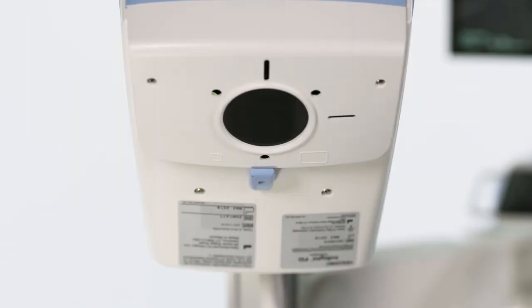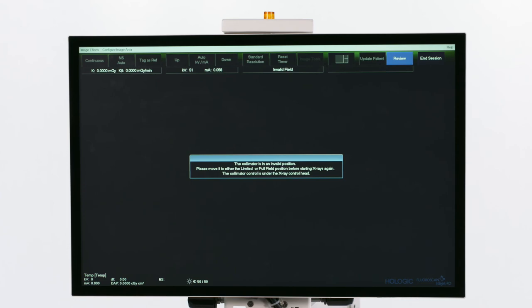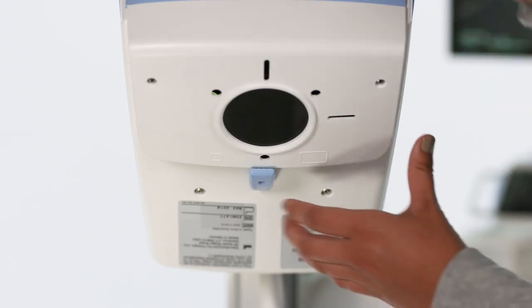If the collimator is left in between the limited view and full field view options, an error message will show up on the screen. Simply move the collimator fully to one side to fix the error.